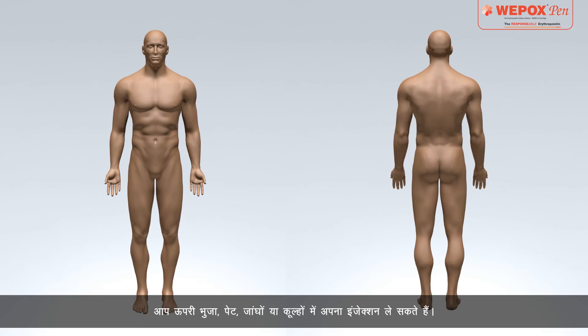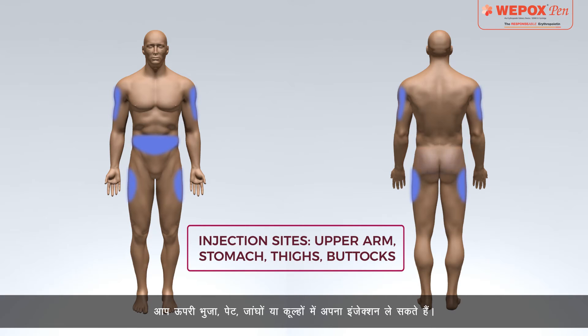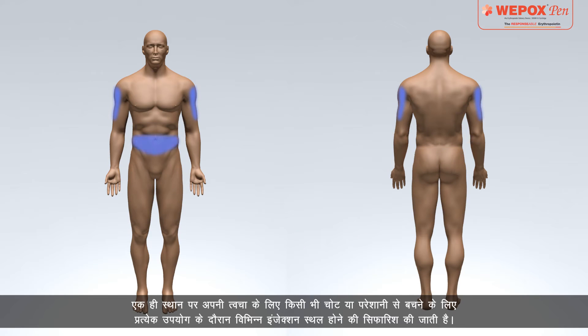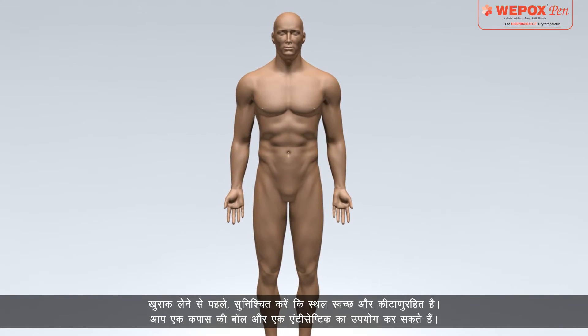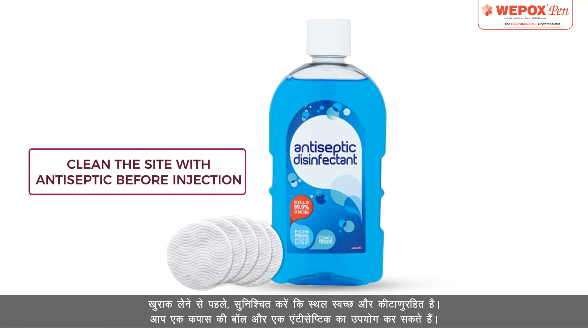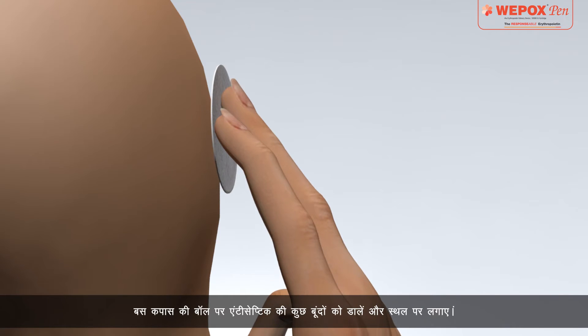You can take your injection in the upper arm, stomach, thighs, or buttocks. It is recommended to use different injection sites during each use to avoid any injury or discomfort to your skin at the same location. Before taking the dose, make sure that the site is cleaned and disinfected using a cotton ball and an antiseptic — apply a few drops of antiseptic on the cotton ball and apply on the site.